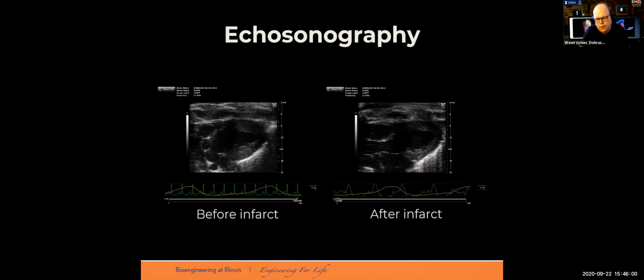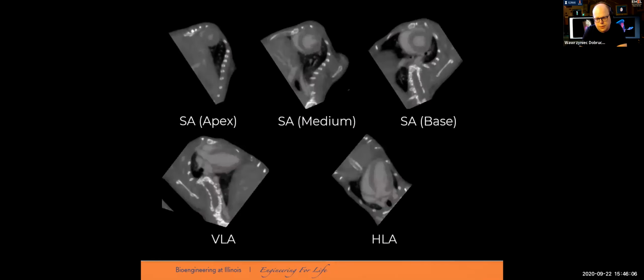But what we wanted to do was to try if we can do this using CT imaging. So these are the images taken using a dedicated micro CT after injection. This is done in mouse, so very, very tiny hearts you can see over here, after injection of the contrast agent, the Fenestra VC. So we acquired those images, as you can see.